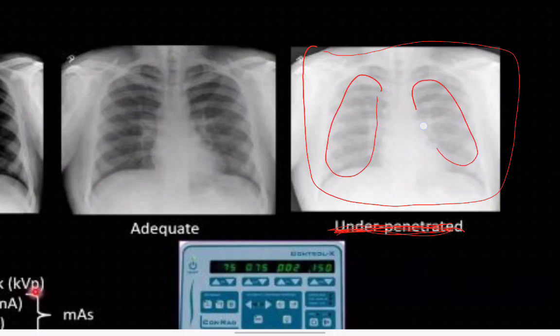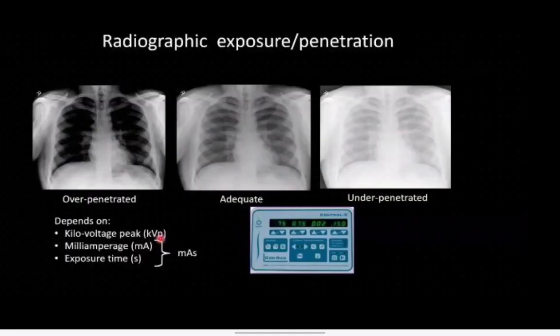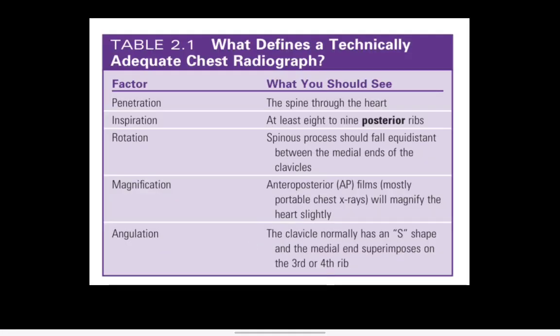There is opacification bilaterally on this chest X-ray, so you can misunderstand it or mistake it for underlying pathology, while this is the image of the same patient, normal with adequate exposure. That's why you, as a doctor, should know the parameters for the adequate chest X-ray.